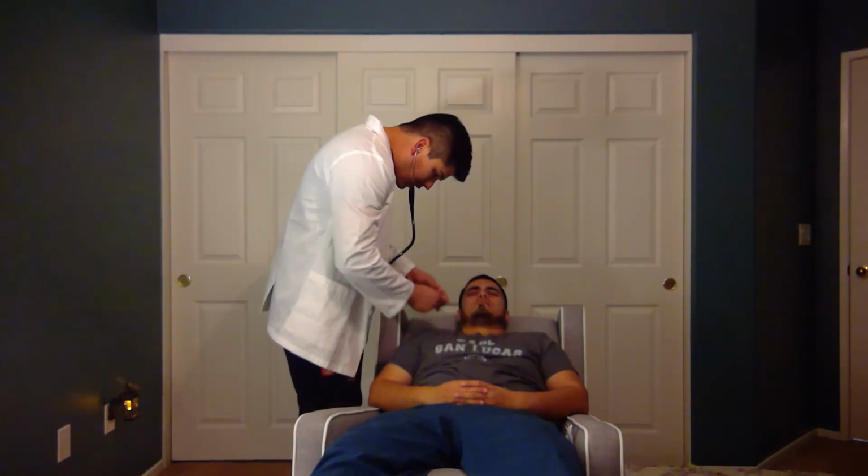Now we're going to go ahead and auscultate. For auscultation, we're going to use our stethoscope. We're going to auscultate in the same areas that we palpated with the diaphragm, and then we're going to turn around and use the bell: more high pitched sounds with the diaphragm and more low pitched sounds with the bell. So we're going to go ahead and start. When you are listening for heart sounds, we're identifying the cardiac cycle, beginning with S1 and S2, and identifying any murmurs, clicks, or extra heart sounds, any S3s, any S4s.